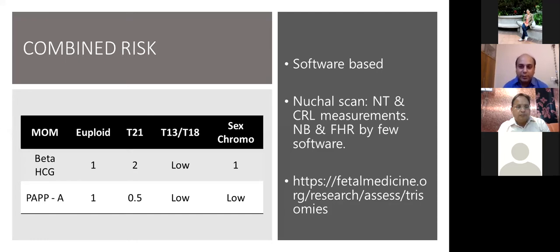That risk is actually software based. This software can be freely acquired from the Fetal Medicine Foundation site if we register and take their certification. However, they have also provided a free online risk assessment tool. This link is here. When we click on this link, we go to this site.